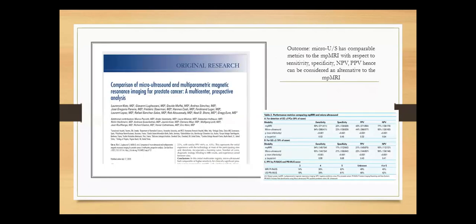So just an article to show us how to, yes, this is an article, a multi-center prospective analysis that compared micro ultrasound to the multiparametric MRI.